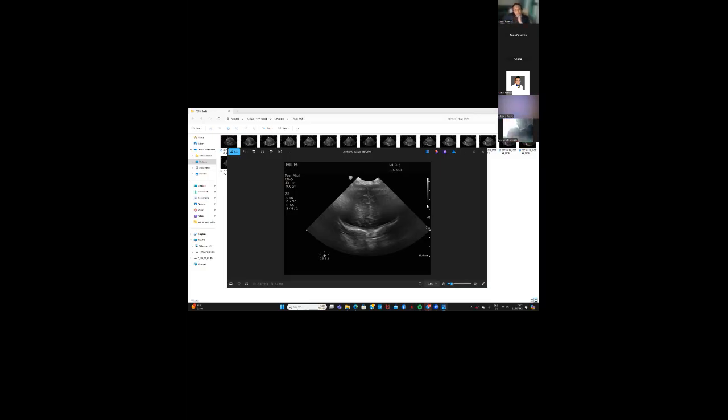This is the C1 where we can see the interhemispheric fissure, along with the orbital ridges visible, and there is a little bit of frontal blush which can be seen on the right side. But on the left side there is some dropout, which I was not able to fix by trying to optimize the settings. No problem.